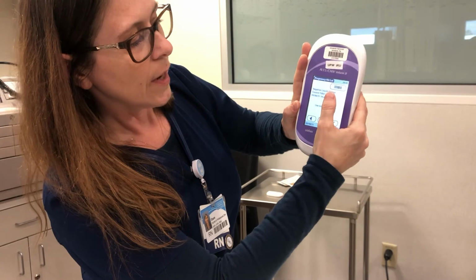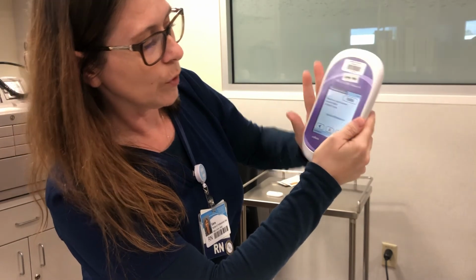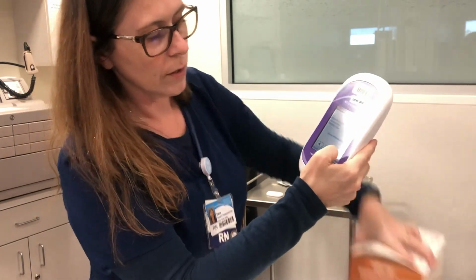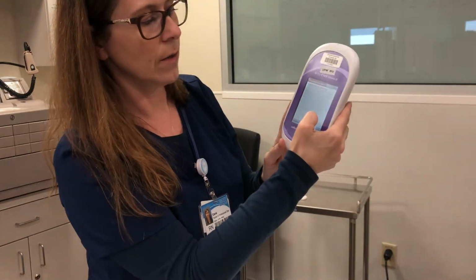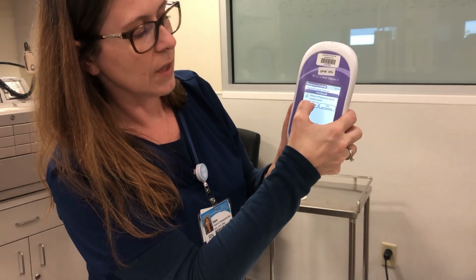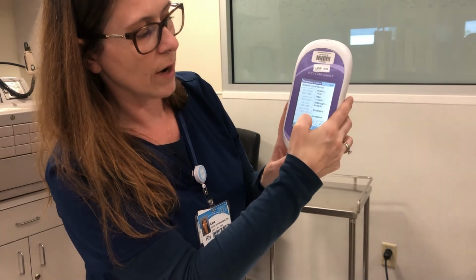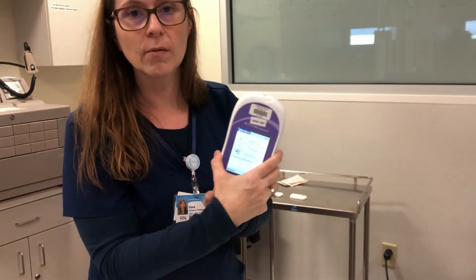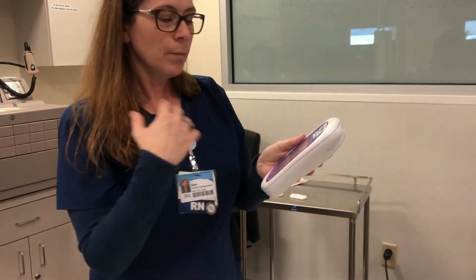Negative liquid control, and we used kit again, 32121. That is correct. And our control was present, and the result was correct. We are done.